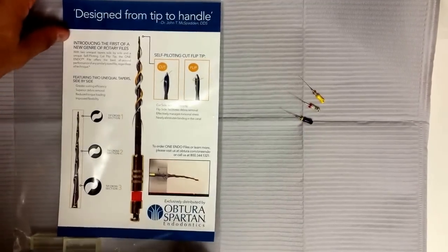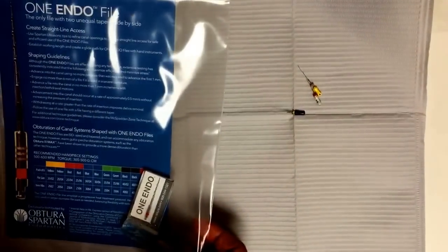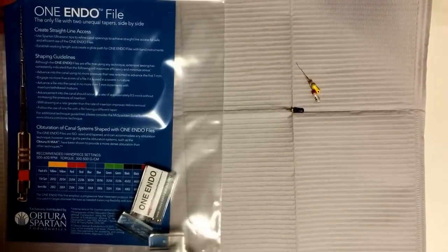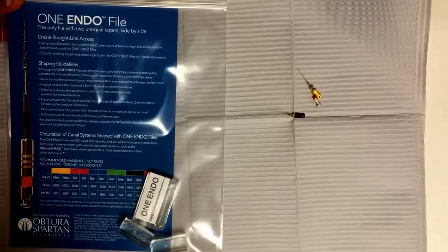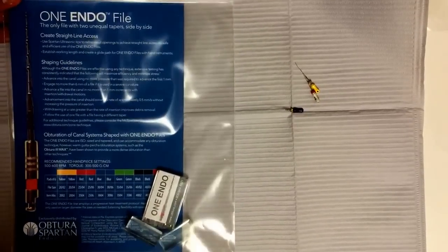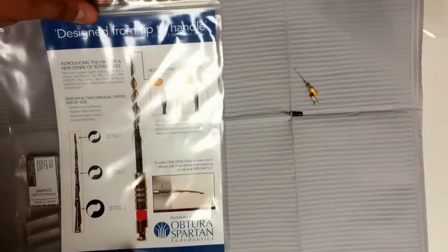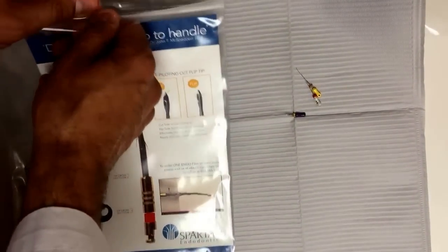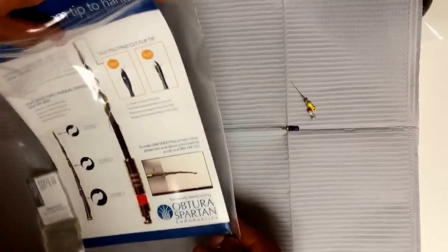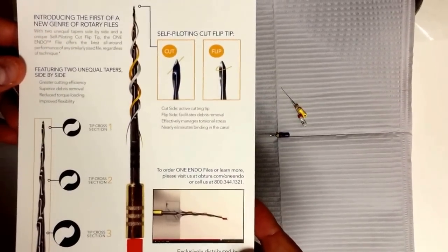We have a video demo here of the new One Endo file from Obtura Spartan. It's designed by Dr. John McSpadden, a real guru in endodontics. He has his own company, Nano Endo, and it's being distributed by Obtura Spartan. I've got the first pack here — a sample pack they sent me, because the Obtura people are really cool. They sent me this file and I looked up the videos John McSpadden made. It's an interesting file design.